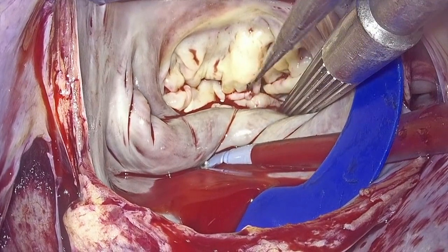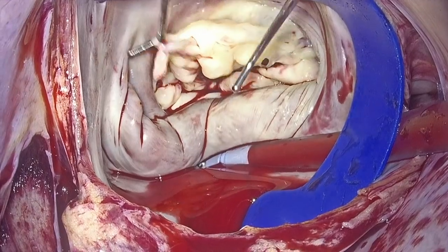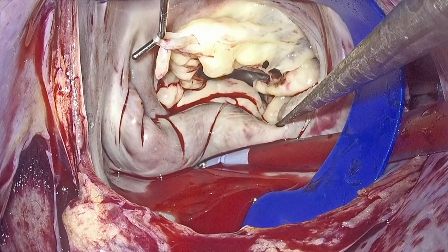The mitral valve was examined and it became immediately apparent that there is a rupture of the chordae in the area of the A2-A3 segments, and also a prolapsed posteromedial commissure and P3.